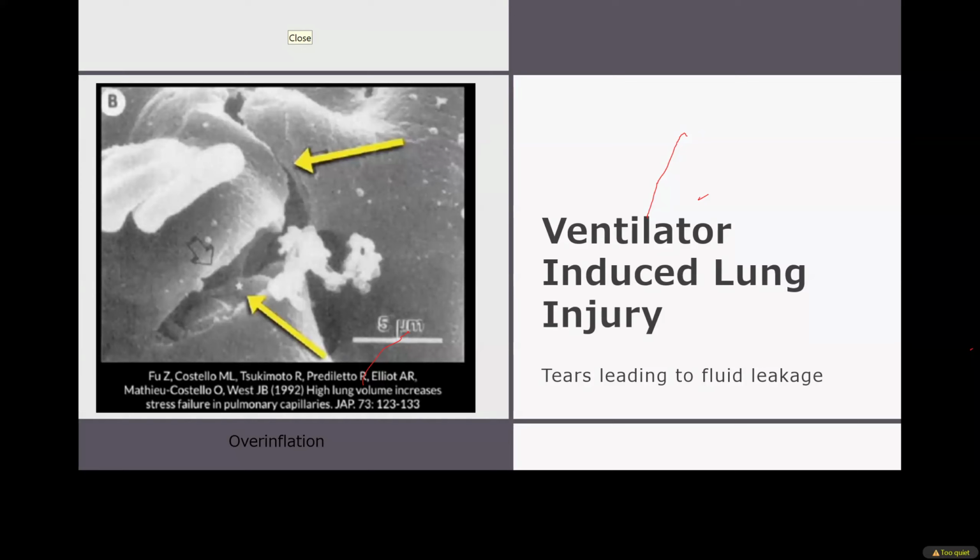The second strategy is, even if you're using the ventilator, try to get the baby off the ventilator as soon as possible. That is the INSURE method, which is basically intubate, surfactant, extubate. That is another strategy most people are using, where you intubate the baby, give surfactant, and extubate right away, and the baby breathes on its own. But in a baby that is not breathing spontaneously or is very sick, you do need the ventilator.